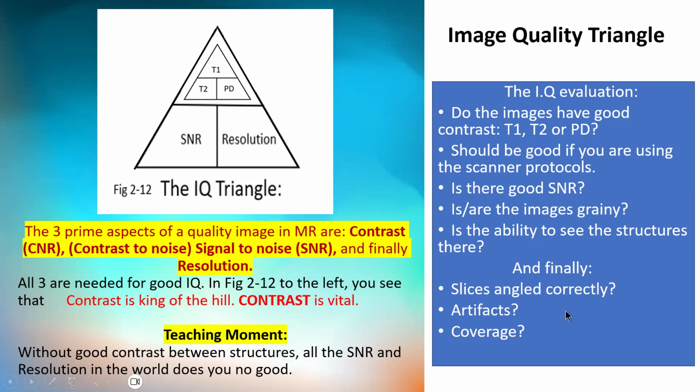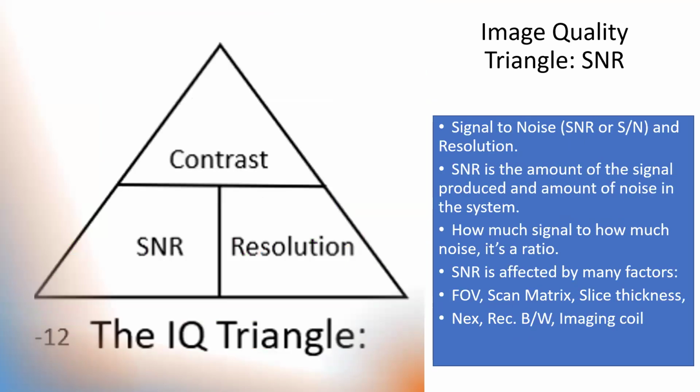Okay. So any one of these, if you go, yeah, no, my contrast is no good, then you're going to have to run it again. If you didn't get good coverage, you're going to run it again. So you want to avoid that.